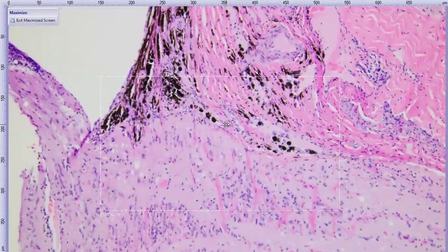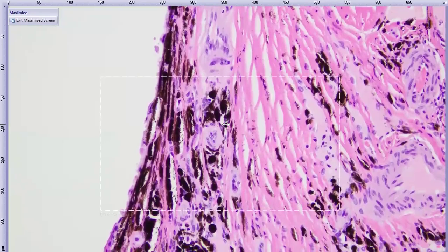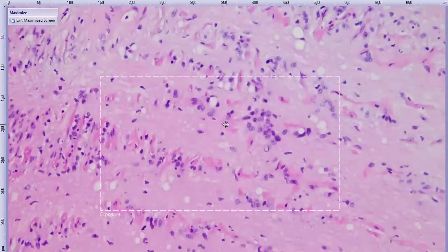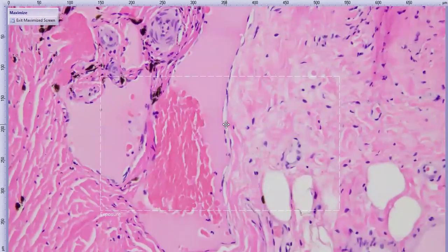If we go back around the optic nerve and take a look at some of those choroidal vessels, you can see how thick they are also. So there's some hypertrophy of the vascular endothelium with mild constriction of the lumen. Another thing I would like to point at, we have this exudate right here in the vitreous. And if you look at the larger vessels in the choroid or peripapillary vessels, you see the same type of exudate inside the vessels. And you can see how it's basically separating the red blood cells in clumps right here.